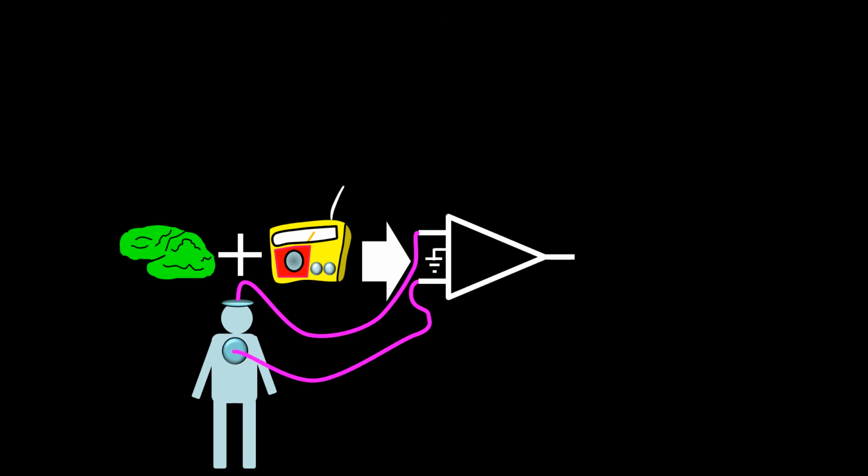Next, in the search for the perfect montage, the early investigators went on to connect input 2 of the differential amplifier to the anterior chest wall.